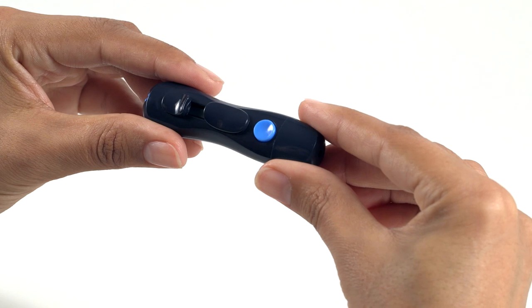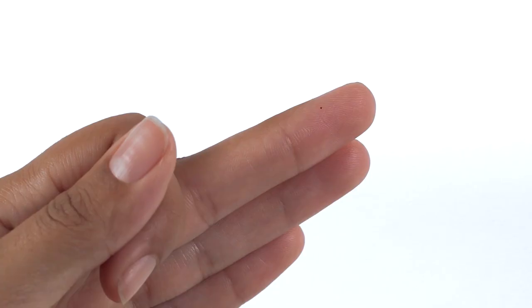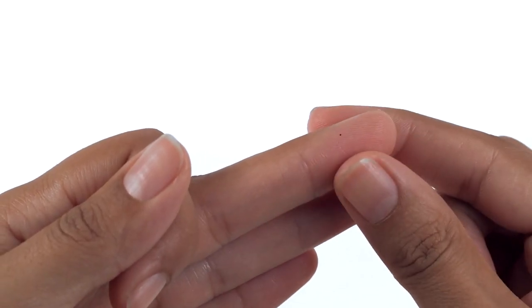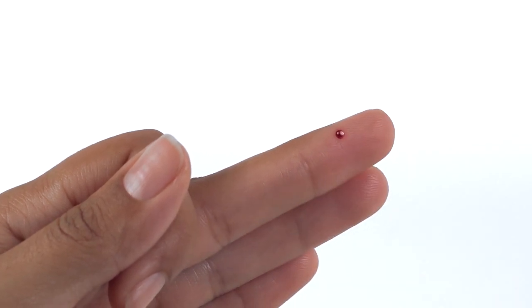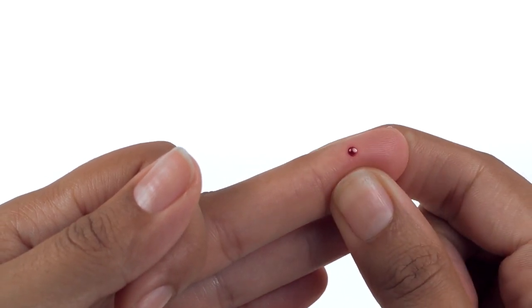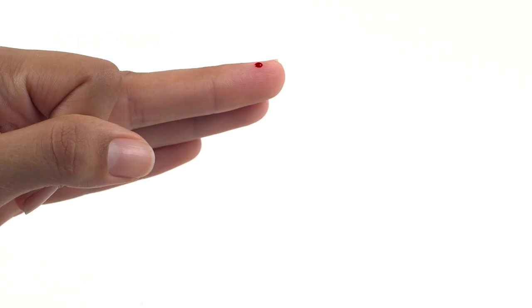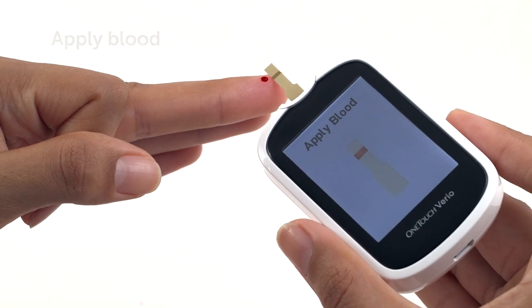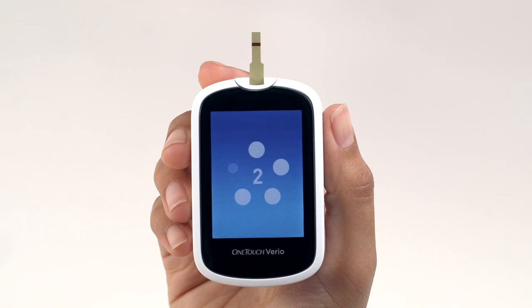Choose a different puncture site each time you test. Repeated punctures in the same spot may cause soreness and calluses. Then, gently squeeze and/or massage your finger until a round droplet of blood forms. If the blood smears or runs, do not use that sample. Dry the area and gently squeeze another drop of blood or puncture a new site. Now you can apply the blood to either side of the test strip. Apply your sample to the opening of the channel. The blood drop will be drawn into the narrow channel. The channel should fill completely. The channel turns red and the meter will count down from 5 to 1.